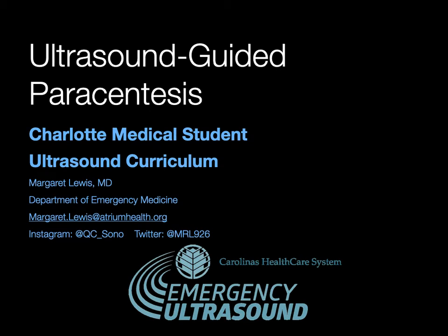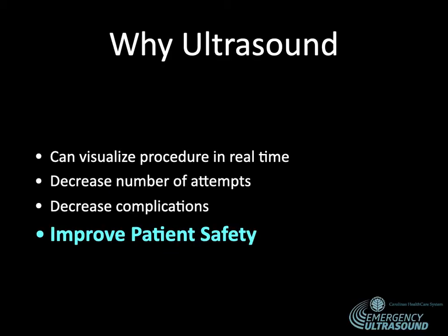Hi all, so now we're going to talk about ultrasound guided paracentesis. This is part of an overall larger lecture about ultrasound guided procedures. So why do we use ultrasound? We want to be able to visualize the procedure in real time. We can decrease the number of attempts, we can decrease the complications, and overall that leads to improved patient safety.